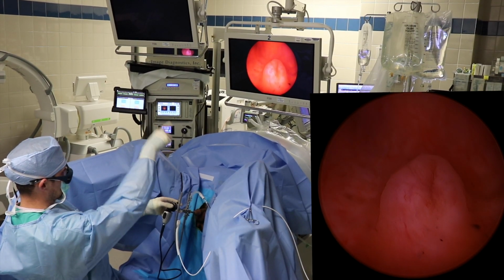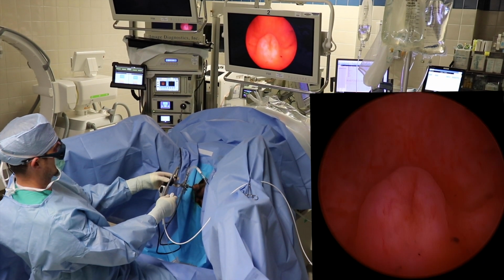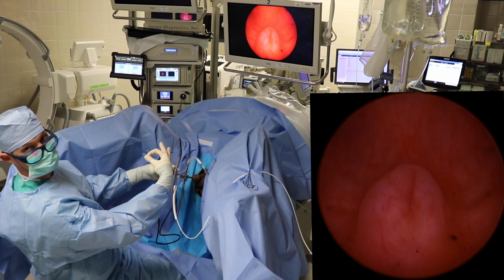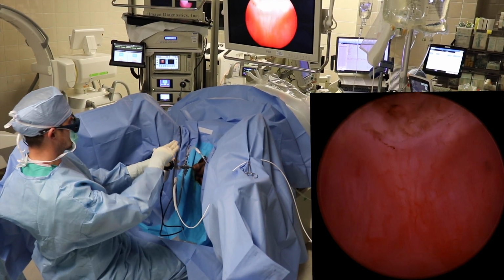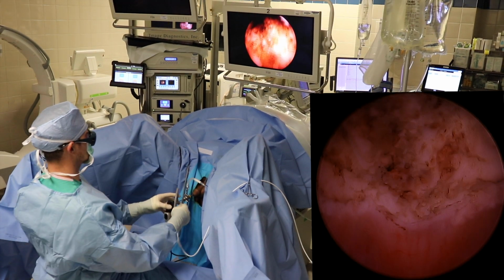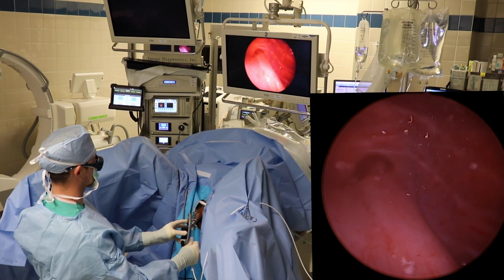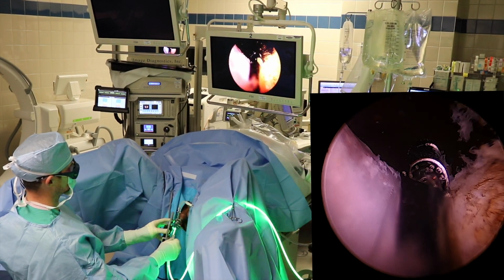Here we can see the verumontanum, which is a small mountain or mound at the end of the prostatic urethra. It allows us to identify where the external urinary sphincter is to allow us to avoid injuring this structure while we are lasering the prostate tissue. We can specifically tell the difference between prostate tissue and where the verumontanum is to allow us to help avoid problems with urinary incontinence.